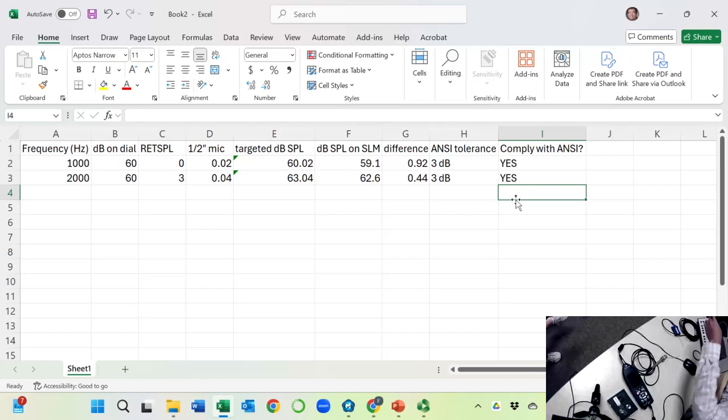Good. So let me move on to the second transducer, the supra-aural headphone. In the meantime, you feel free to grab any chocolate to eat. And I'm going to swap out the transducer. Yeah, I finished them all, so I have an excuse to buy new ones. To be honest, those were left over from the spring semester, so I think they are still good. But I have a quick question.